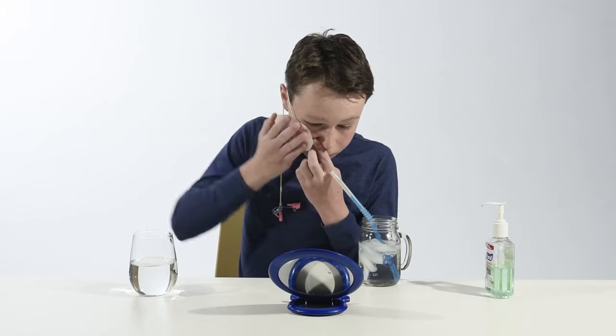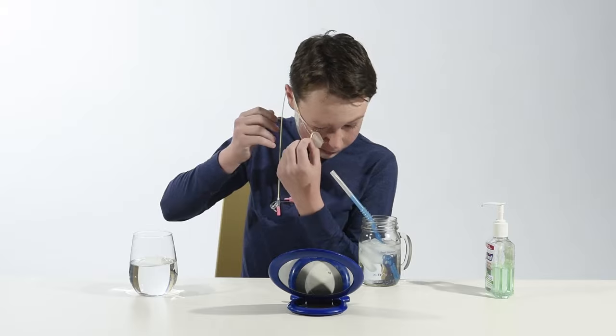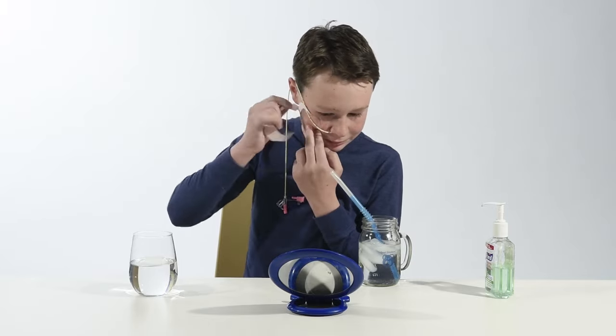If you have determined the tube is in the right place, you can remove the guide wire and securely tape the tube. You are now ready to give feeds or medicines through the tube.